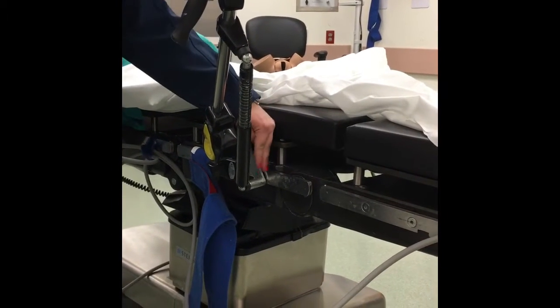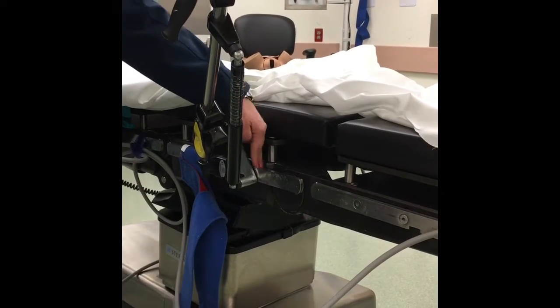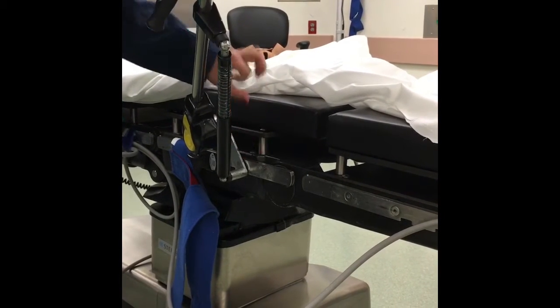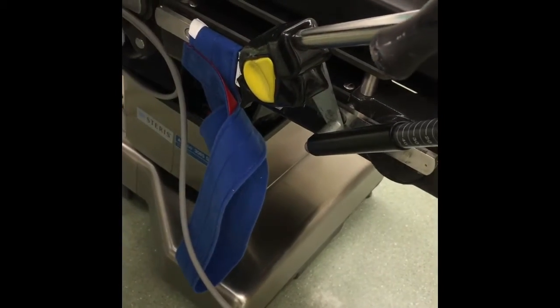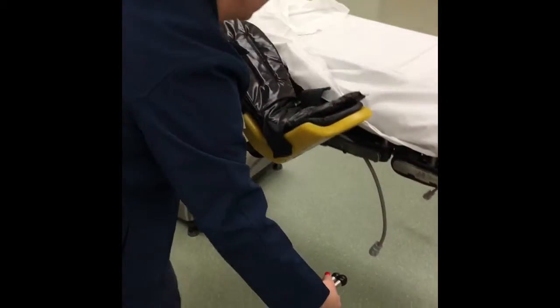Now, to make sure that it's in the right spot, there's a little section that you can line these two up together. It's kind of like the part of the bed that's a circle, and you can see that on the top. So you line these up, and then you can tighten this in. You tighten it all the way until you feel it's tight. And then you're gonna lower it down for when the patient comes into the room.